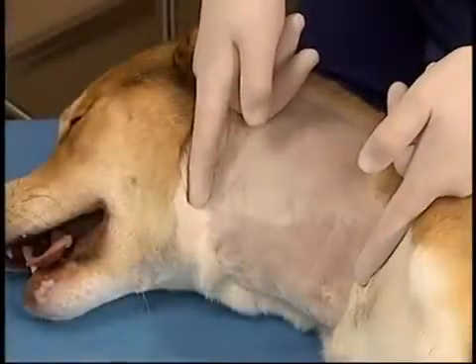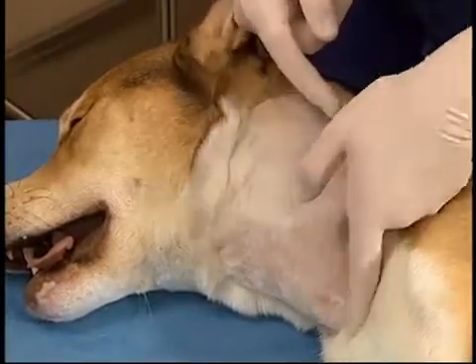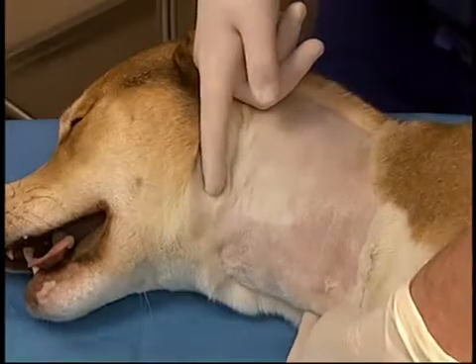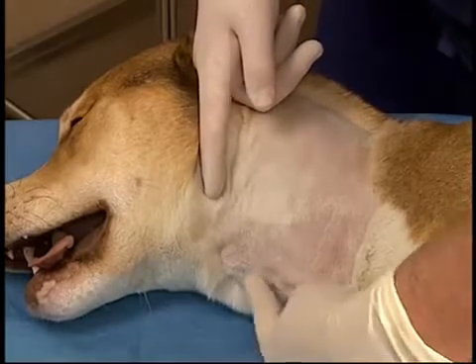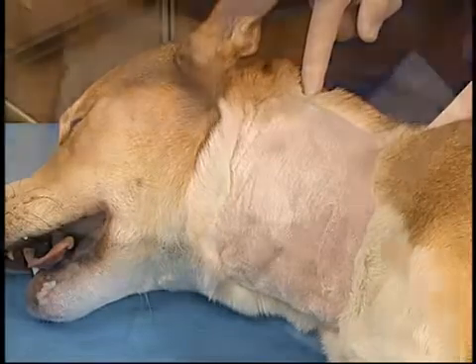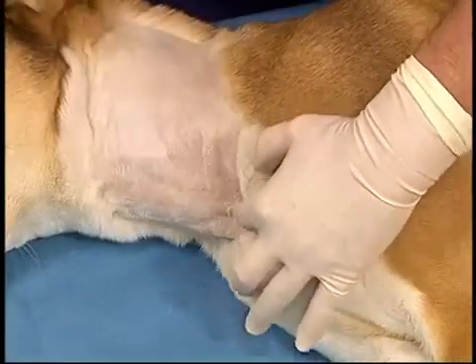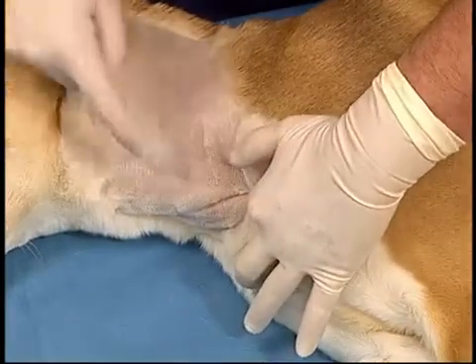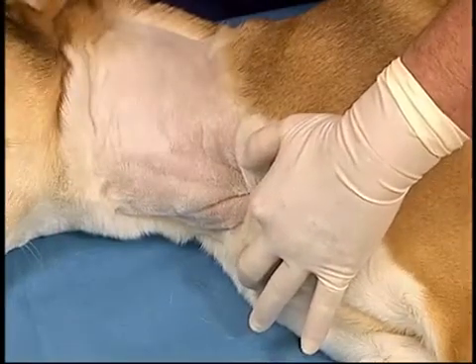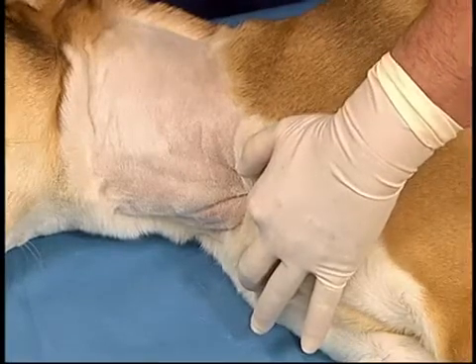The animal is clipped, surgically prepped, and drapes are placed. The drapes are being left off for visualization purposes. The clip should extend from the dorsal midline to lateral to the ventral midline and from the angle of the mandible to the thoracic inlet. When holding off the jugular vein, care should be taken to ensure that the index finger depresses directly into the thoracic inlet rather than retracting the skin caudally, which will flatten the vessel.